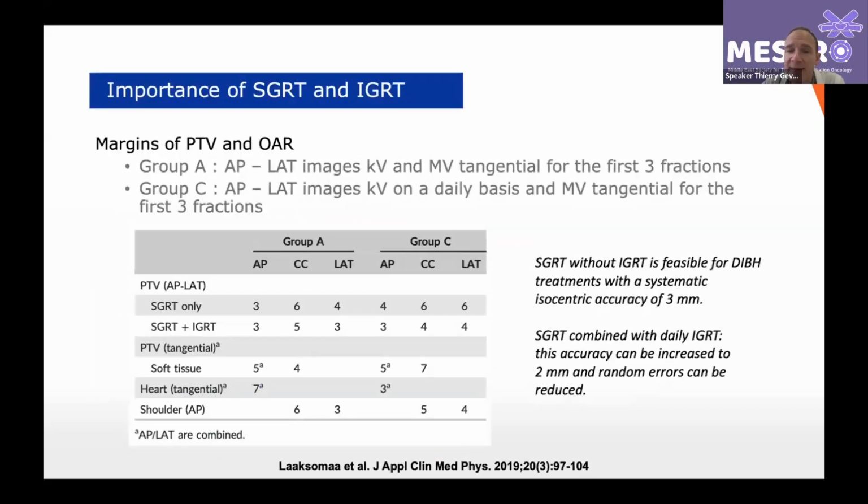And I'm not saying anything new regarding surface and image guidance. We have publications for breast cancer showing that if you apply surface guidance together with image guidance, you can have a decrease in margins because you are more accurate. So that's something we keep in mind.